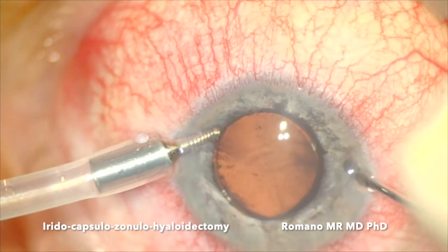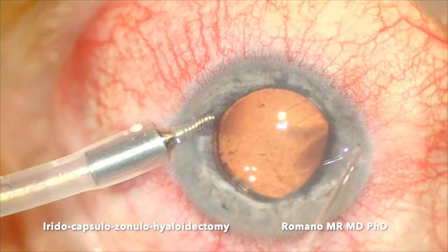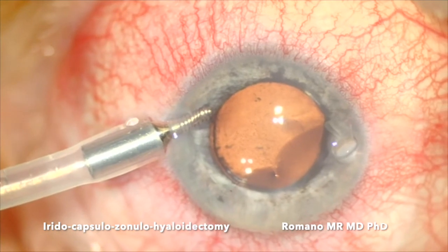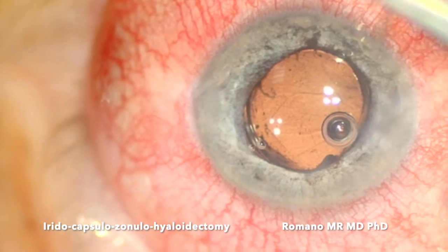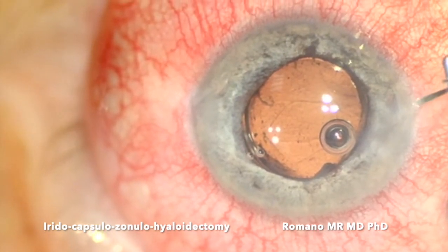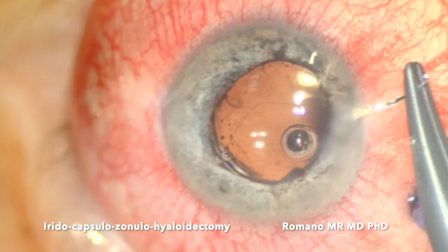As you can see here, you can see the flow going through, so now there is an open communication. This is very important because if you do just iridectomy with the YAG laser it doesn't work. In this case it works very well because there is an open communication between the anterior chamber, posterior chamber, and the vitreous chamber.